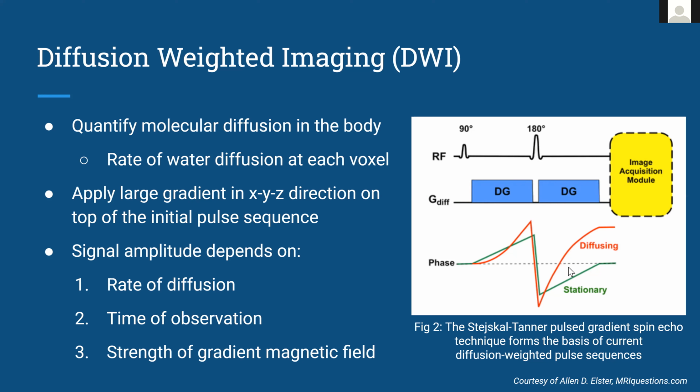As we see on the right image, the molecules that are truly stationary will rephase after the 180 pulse. However, those that are diffusing will dephase even after the 180, and therefore you will get attenuation of the signal.